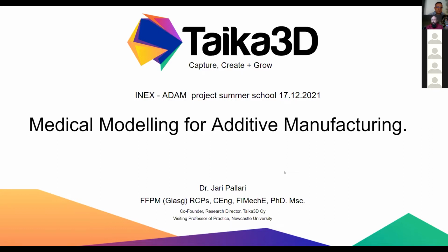Thank you, Damir, for the invitation to this demonstration and to the previous presentation as well. My name is Jari Palari, and I'm from a small company called Taika 3D. We are based in Espoo in Finland and in a couple of locations in the UK. Our field of business, which is the same as this demonstration, is the design automation of the orthotics and prosthetics industry, or O&P.